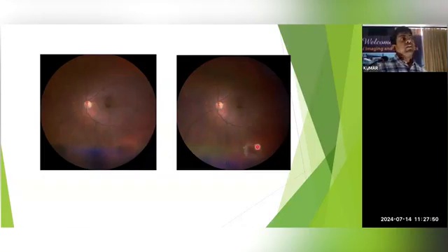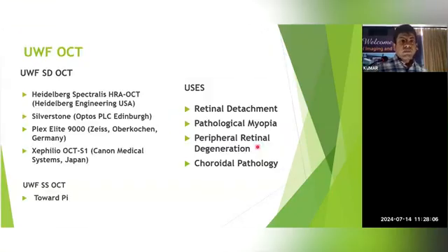So with wide field imaging, even in all cases, we try to take images, and only taking the image is not enough. You have to go and evaluate also. The main utility comes once you analyze and try to find any additional findings. That's where the importance lies.